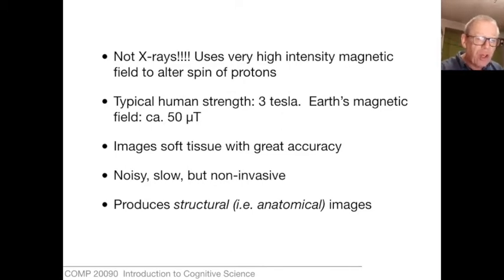This is why, of course, if you are going into a scanner, you must take out any metal, jewellery, implants and so on, because they'll be ripped right out of your body otherwise. It is, however, non-invasive. X-rays damage the tissue that they pass through, but MRI scanners don't do any damage. They generate images which are of great accuracy and spatial resolution, but they take a while to do that. It's a slow procedure, it's noisy. Subjects in the scanner are not allowed to move, but it does them no harm other than the slightly odd feeling of being stuffed into a tube.